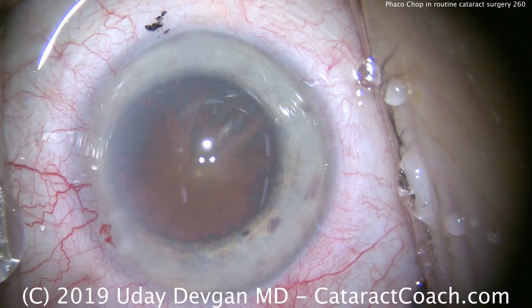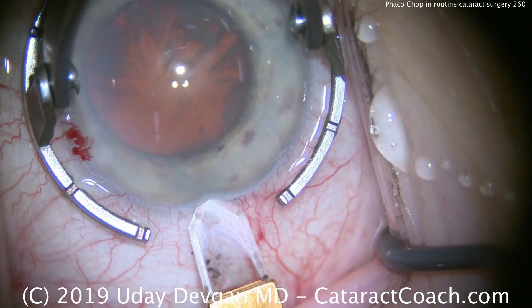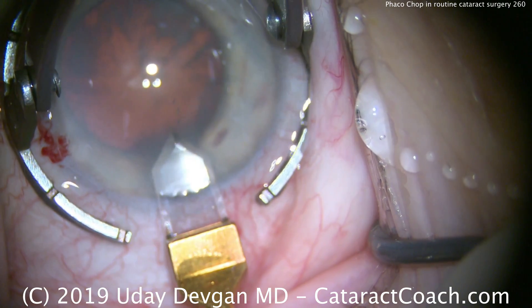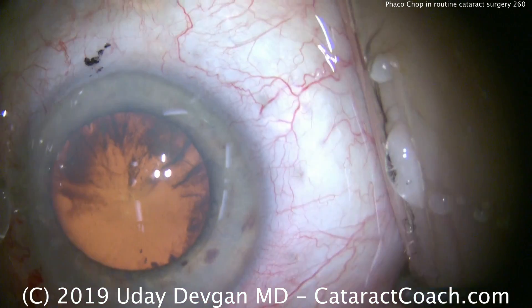It looks like a pretty good dilation here, but keep in mind it's a small eye. Look at the eye compared to the fixation ring — even the diamond keratome looks so large compared to the eye. This patient does have a small corneal diameter.